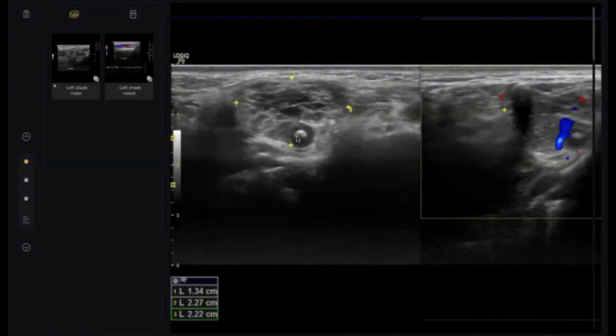This could be a stone, because it appears hyperechoic. Or a soft tissue vascular lesion with phlebolith, which could represent soft tissue hemangioma. Yes, vascular malformation, vascular tumor, anything. Vascular malformation. But you are in the vascular pathway.